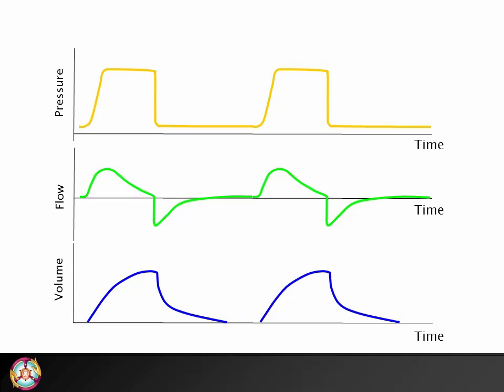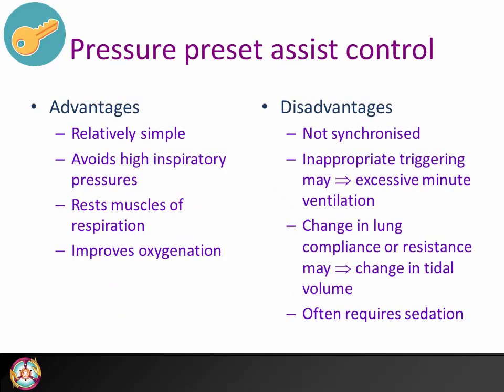As the pressure is set and the inspiratory time is set, changes in resistance and compliance will result in changes in volume. It is therefore important to monitor the tidal volume. Its advantages are that it's relatively simple, avoids high inspiratory pressures, rests the muscles of respiration, and improves oxygenation.